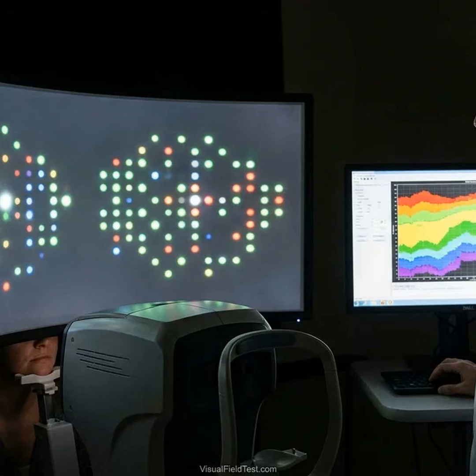This article reviews these color and contrast-specific perimetry methods and how they relate to glaucoma and optic nerve disease. We discuss what blue-yellow and red-green perimetry can reveal about pathway dysfunction, how flicker perimetry examines temporal contrast processing, and how these functional losses map onto structural imaging, OCT, and blood flow metrics, OCT angiography. We also consider evidence on whether such targeted tests predict later decline on standard fields and suggest practical testing protocols that maximize diagnostic insight without overly straining patients.